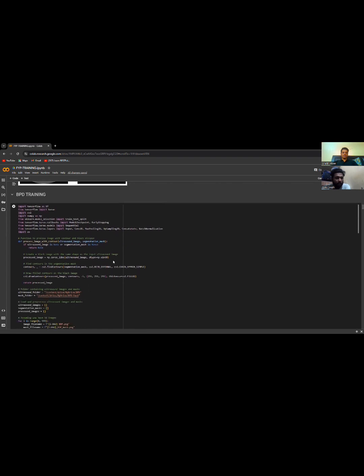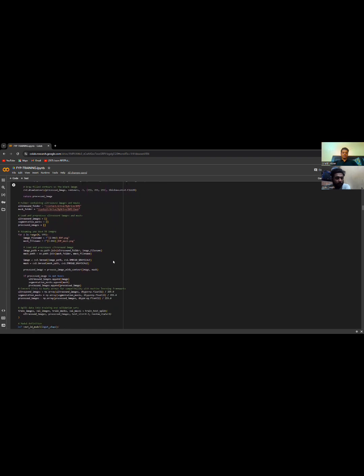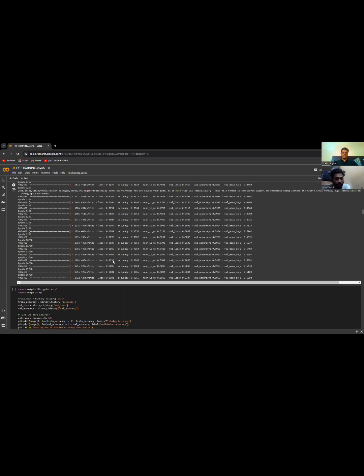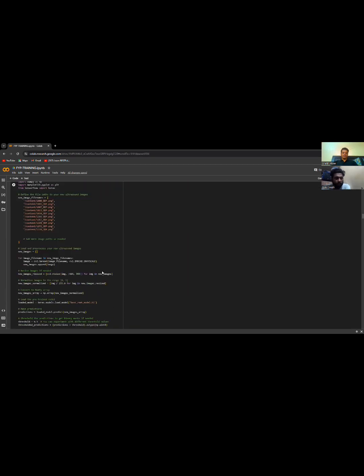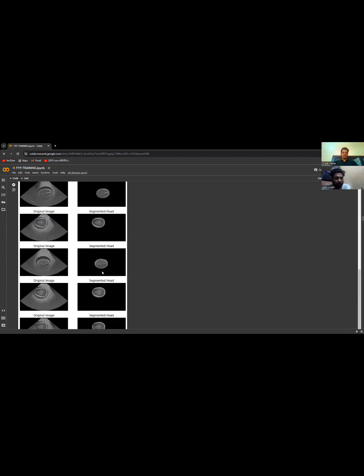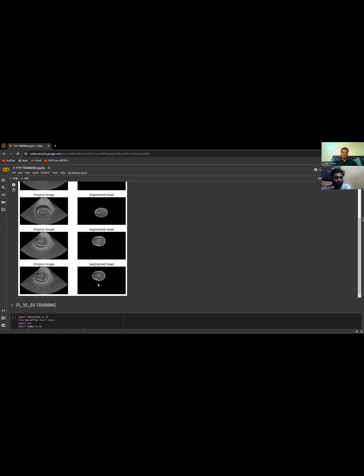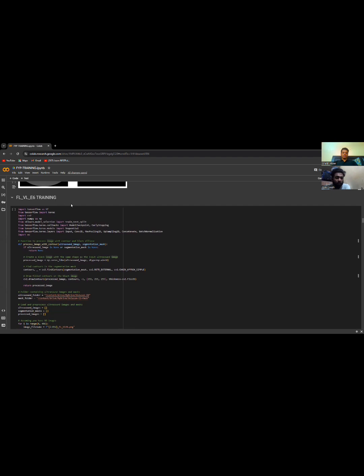Now, same as that, we trained our BPD parameter, biparietal diameter, with the same training and validation accuracy. But BPD is a little different, because in BPD we were calculating the diameter of the head.